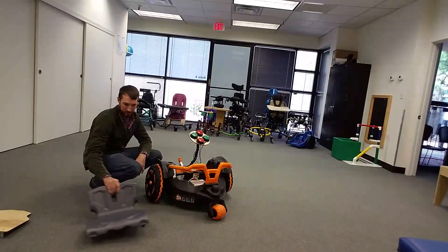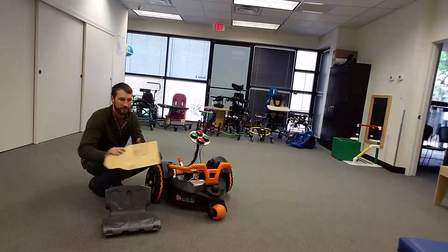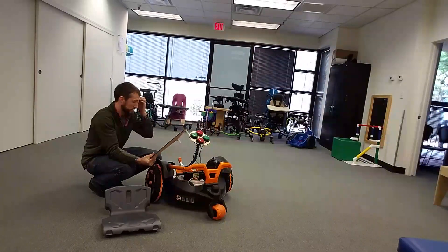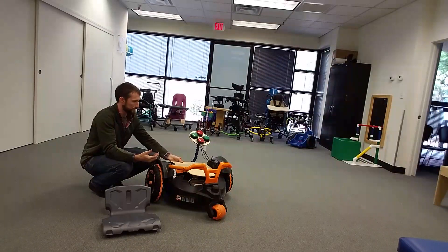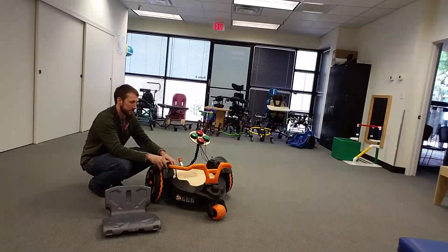There's the stock seat — it's got a clip on the front. I've also been fabbing up a quick seat to go on top that will allow us to provide a nice supportive backrest as well as contoured seating, just to help with stability. We'll keep working on this and keep you updated.